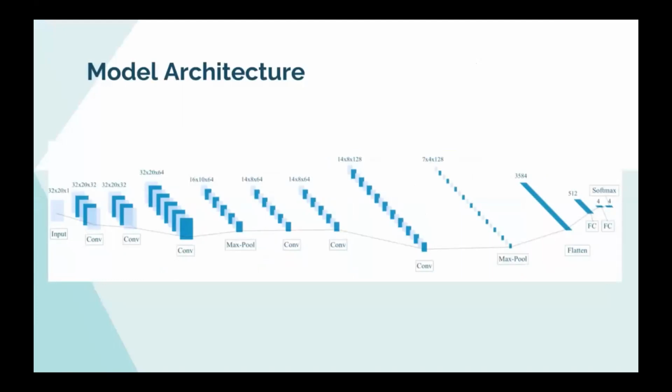The architecture of our model can be seen in the image above. Once we identified the electrodes we needed to classify our data, our model's performance was significantly improved, and the problems we faced with overfitting were reduced, making it much easier to find a model that can perform the classification task at hand with very high accuracies, while still being able to generalize well and classify EEG signals obtained from any random subject.